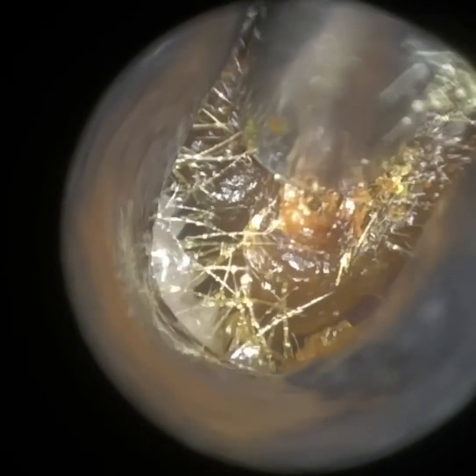The oil has helped slightly, but you can see it's still really, really impacted. Being a child, they've got a very narrow ear. The wax has been pushed in — the child has been poking in the ear.